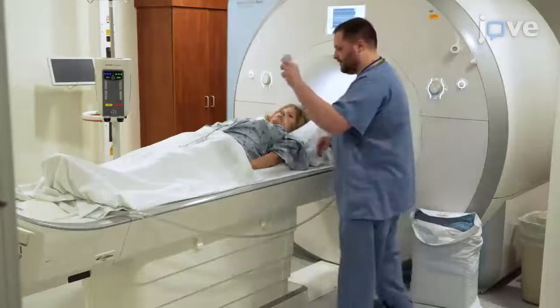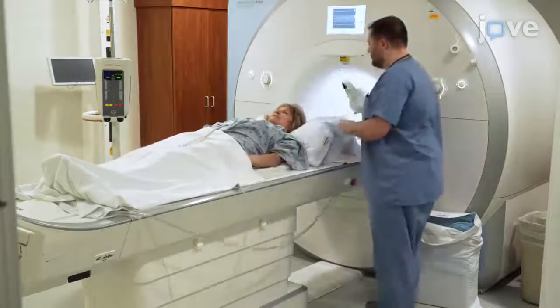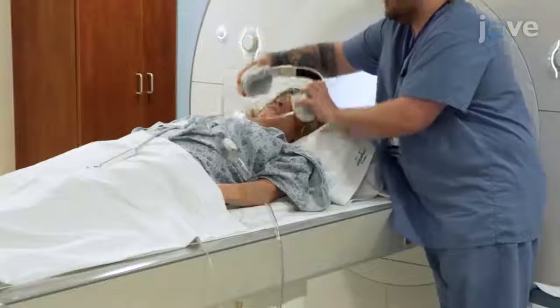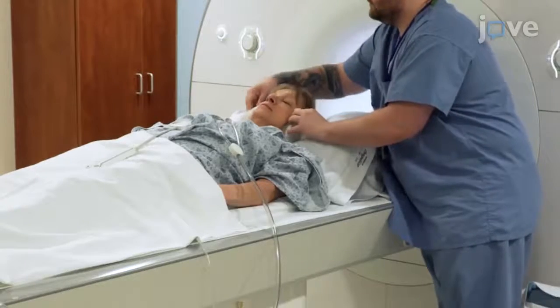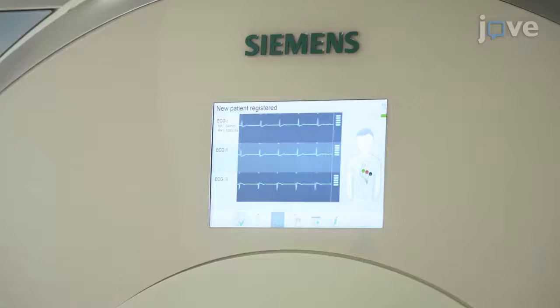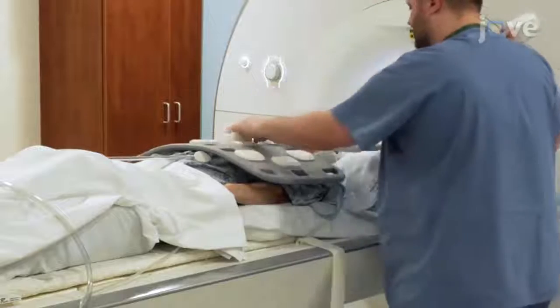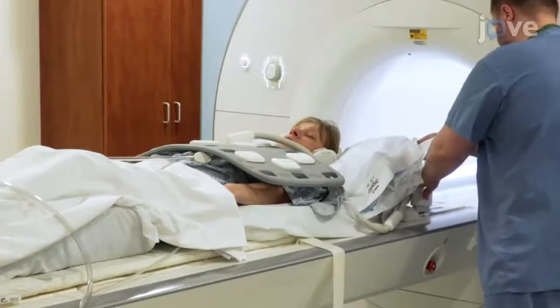Before beginning the acquisition, provide the patient with headphones connected to the technologist microphone so that commands can be efficiently communicated, and place electrocardiogram leads in the optimal positions on the left chest. After confirming adequate EKG signal, the patient's position is confirmed on the scan table and an appropriately sized surface coil for maximizing signal-to-noise ratio is placed over the heart.